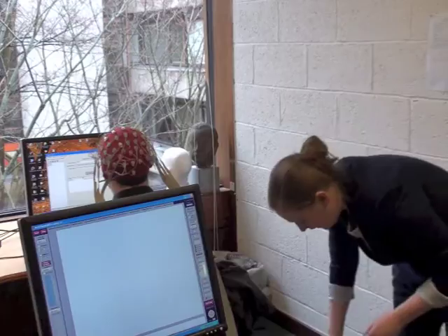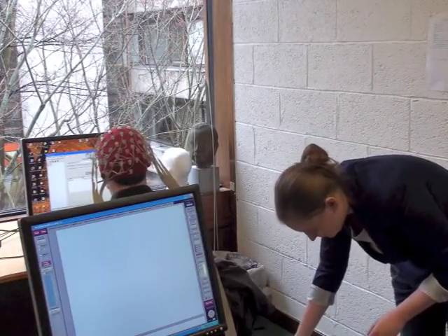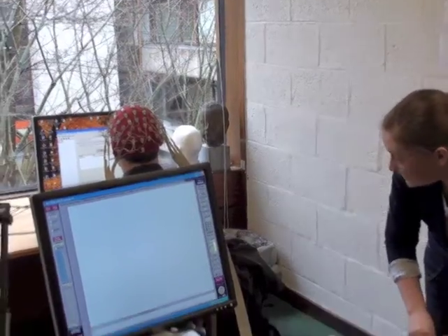And I'm not sure if you're going to go into this later, but isn't there also a way where you can filter out something like a blink? Yes. Later on in the stage of analysis there is.